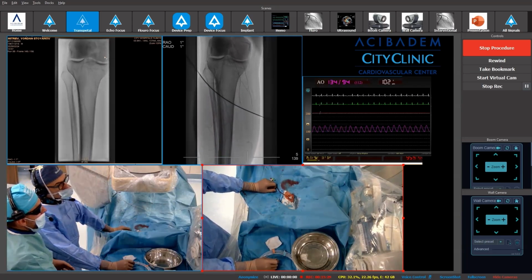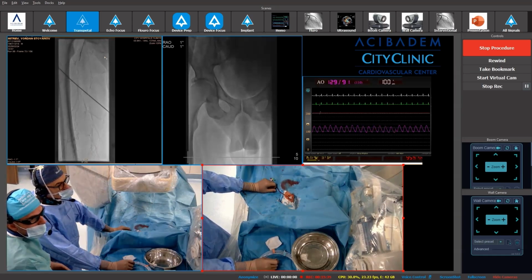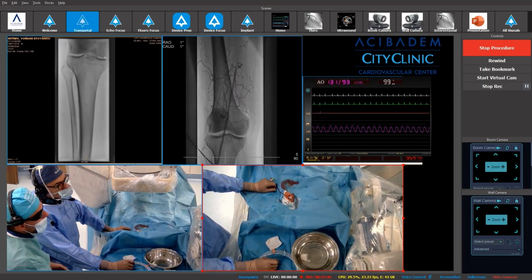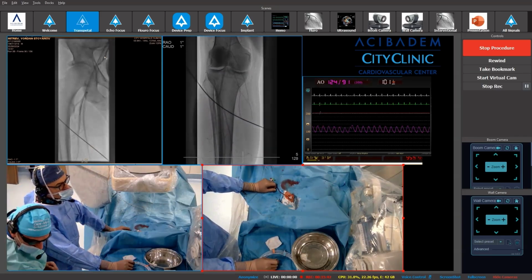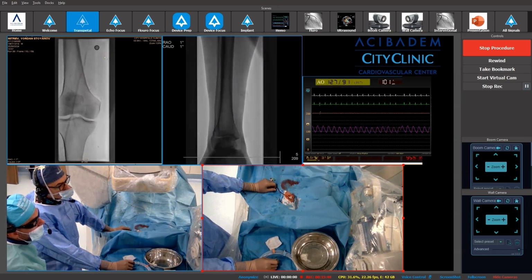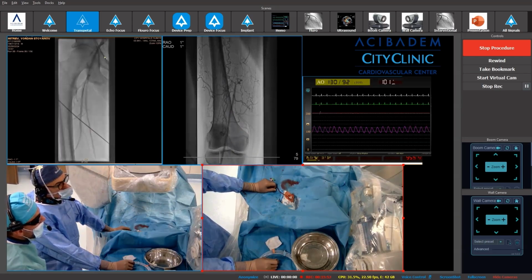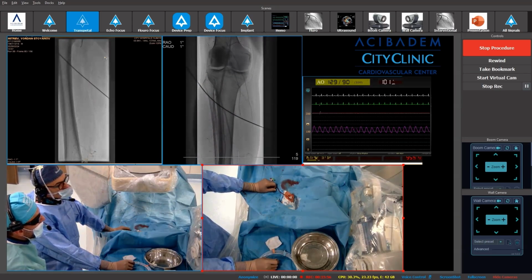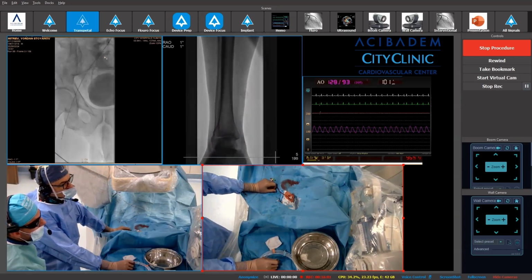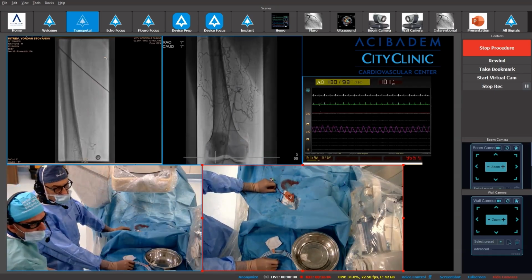You will probably share our opinion that in many cases with a huge collateral from the proximal cap, the penetration is not very easy, and the wire tends to go subintimally, making a dissection. It's better to stay inside the lumen, and because of that, we prefer the tibial approach for the penetration, because the probability to stay in the lumen is quite higher. What do you think?